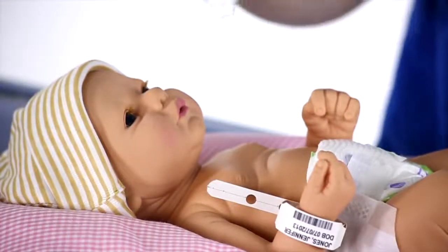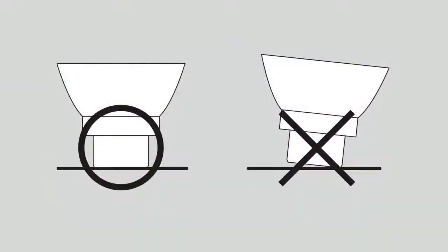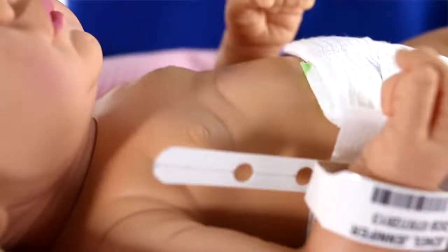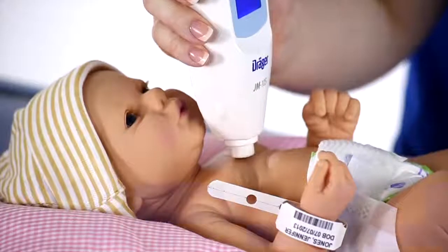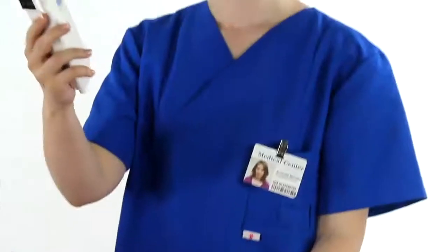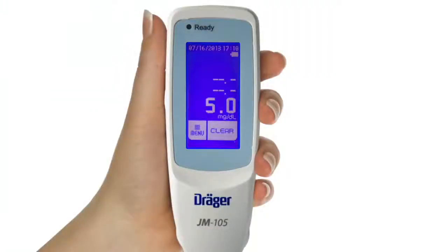Holding the JM105 vertically, gently position the measurement probe flat against the infant's skin, leaving no gaps between the probe and the skin. Gently push the probe until you see a momentary flash of light. Because the xenon lamp emits intense light, be careful not to press the probe when it is directed at the eyes. The measured transcutaneous bilirubin value will appear on the display.